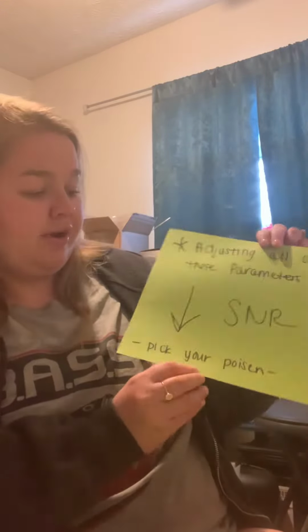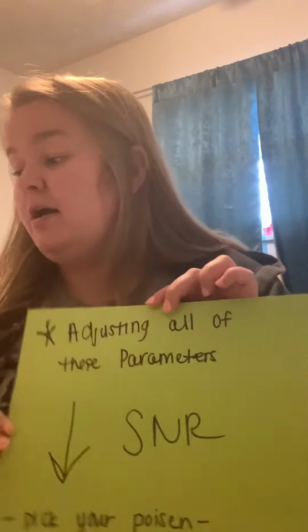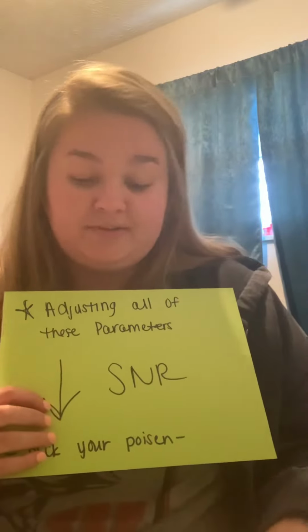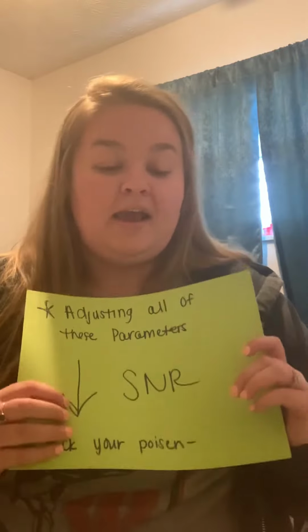Adjusting all of these parameters decreases your signal to noise ratio. So just like the resolution, you have to pick your poison. You have to decide as the MRI technologist which is better for your patient and proceed from there.